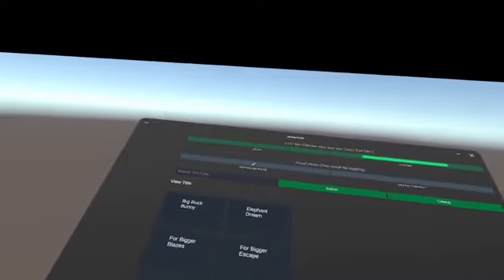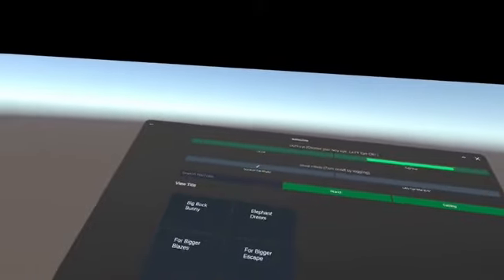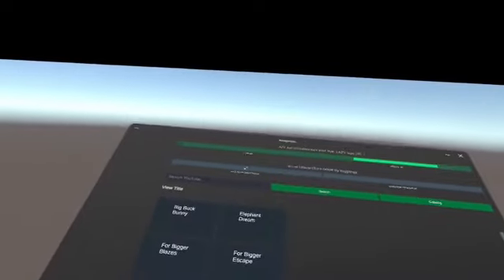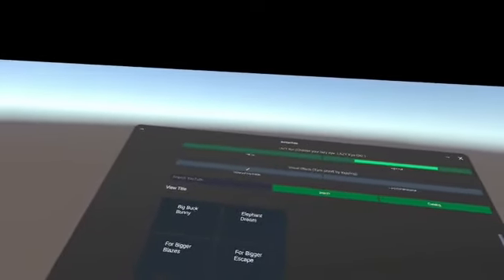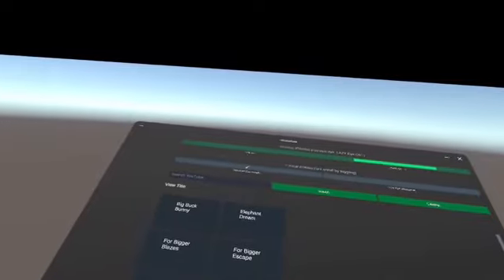Moreover, with the red and blue eye shading in the red and blue glasses, you change the natural color of the environment, okay. So the therapy is only targeted in a red and blue shade. So both your eyes still do not work together in a natural environment, but VR creates an environment which is very natural, okay. It selectively removes the objects or tweaks or adds some flicker to those objects. If an object is in your lazy eye, it creates a flicker in it and it makes it sharper, so your lazy eye can automatically give attention to that object.